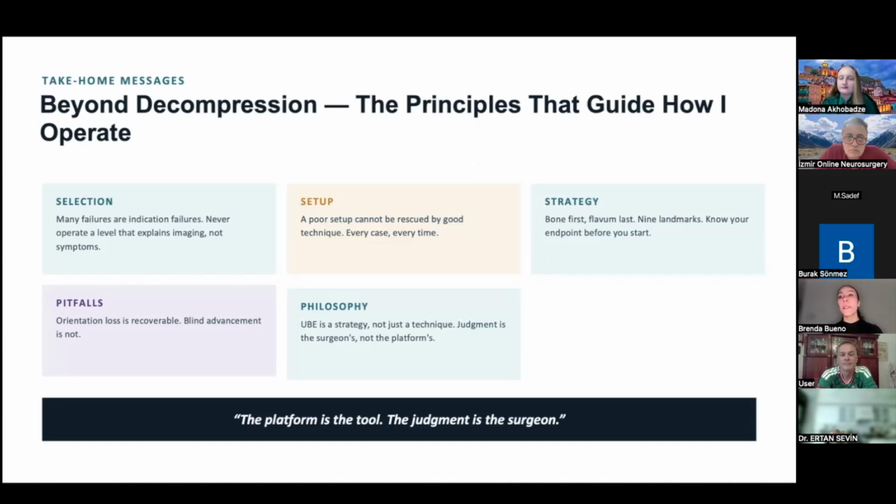This is 50% of just your surgery again. If you are lost, take a stop, take a minute to reorient. This is possible. So never follow your surgery if you had a bleeding or you're not sure where you are.